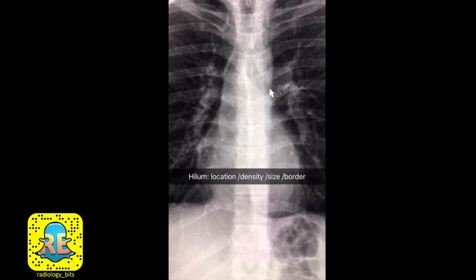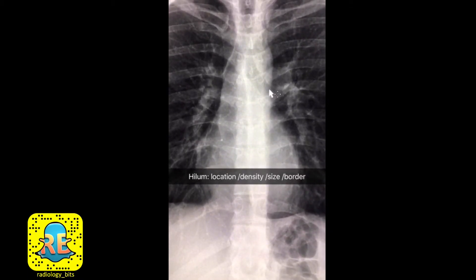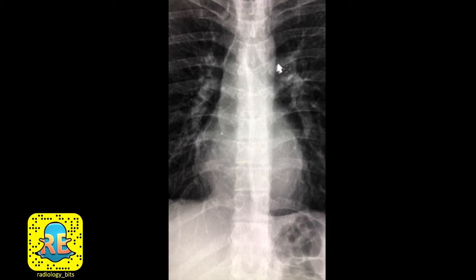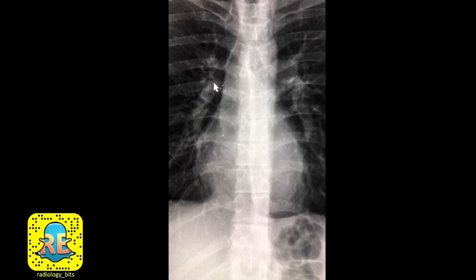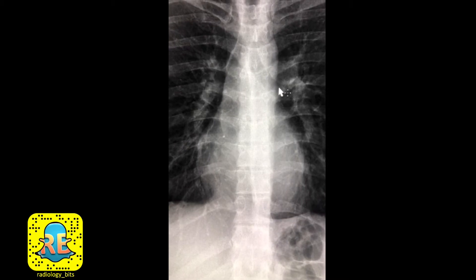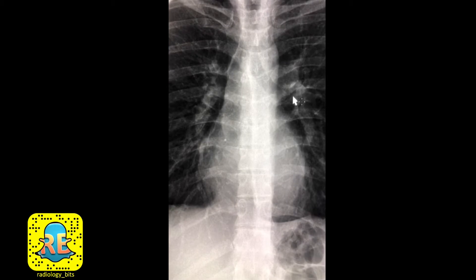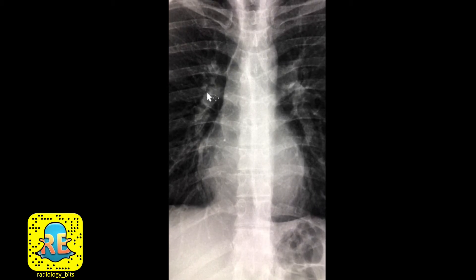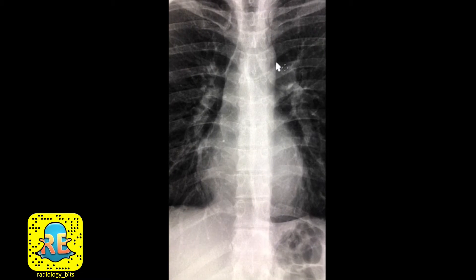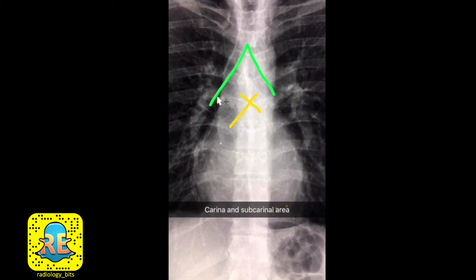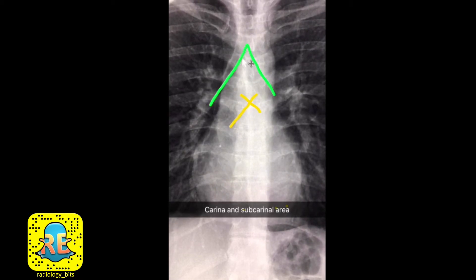The hilum can be assessed by checking four points: first location, second density, third size, and fourth border. In a normal case, the left hilum is slightly higher than the right. The hila should not have increased densities and should be symmetric in density. They should not be increased in size — size should be equal comparing right to left — and should not have any bulging borders.